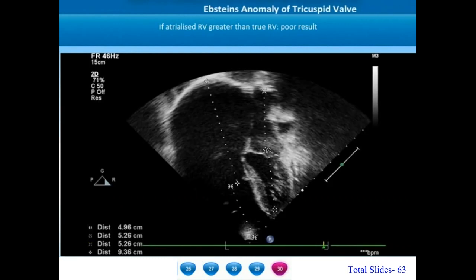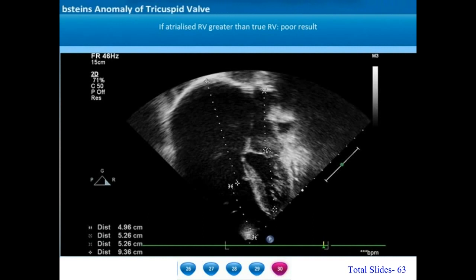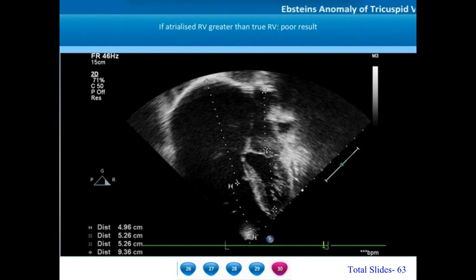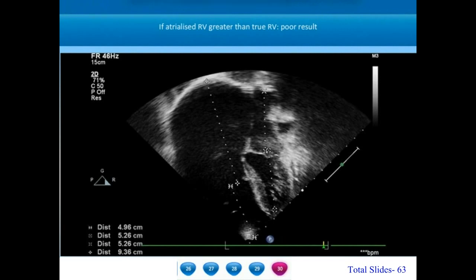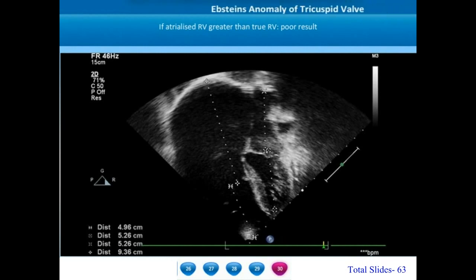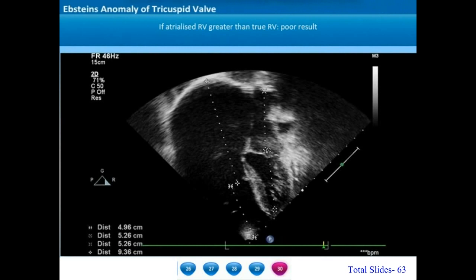Another way of identifying the size of the atrialized right ventricle is by measuring the length of the right atrium and atrialized right ventricle and comparing with the lengths of the right ventricle, left atrium, and left ventricle. Here, the combined height of the right atrium and atrialized right ventricle is about 9.3 cm, while the true right ventricle is about 5 cm. This is a relatively milder form of Epstein's. If the atrialized right ventricle is much larger than the true right ventricle, surgical results are poor.